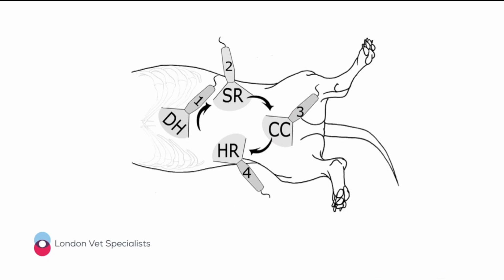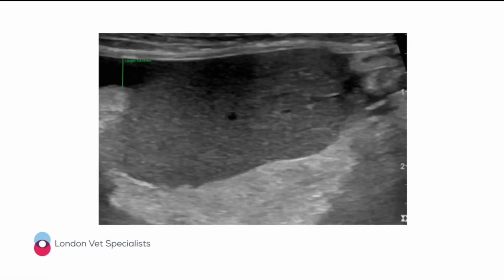We sometimes need to be objective, or as objective as we can possibly be, about whether the fluid that we've previously detected in an abdomen has increased in volume or not. And the way to do this, again, this is very subjective. With the patient in right lateral recumbency, just touch the probe against the most dependent part of the abdomen, just like it's shown here in region 4, at the level of the umbilicus. And just very roughly measure the amount of fluid that's present. So in this instance, there's not very much fluid at all, so there's about 0.5 centimeter of fluid.